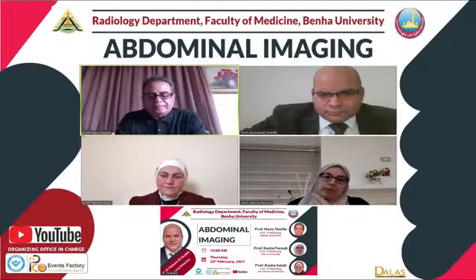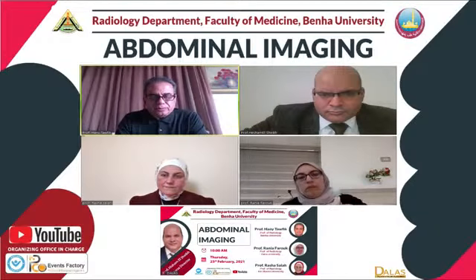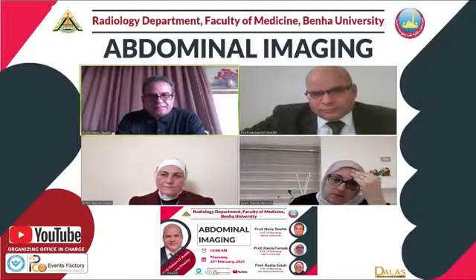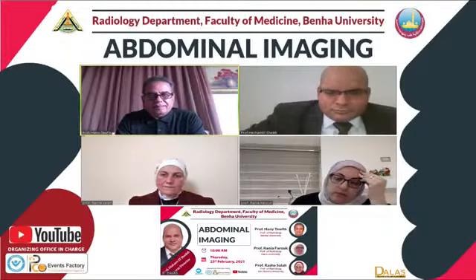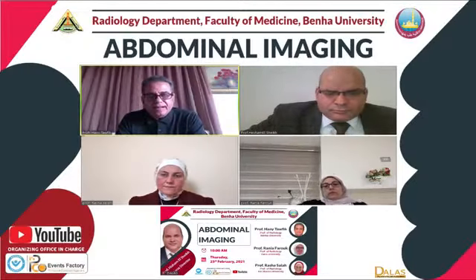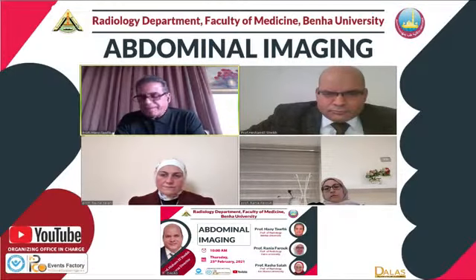المشكلة إن في بعض الراديولوجيست ما بيبقوش oriented بالكلام اللي قالته الدكتورة رشا، وبعتوا لنا تقارير ما بتفيدناش. يعني لازم التقرير يغطي كل اللي قالته الدكتورة رشا بالظبط، يعني بالنسبة للـ T staging، بالنسبة للـ circumferential resection margin، بالنسبة للـ lymph node status، بالنسبة للـ lymphovascular invasion، بالنسبة قد إيه من الـ mesorectum متاخد. يعني ده مهم جدا، ففي كتير قوي ما بنلاقيش في التقرير الحاجات دي.